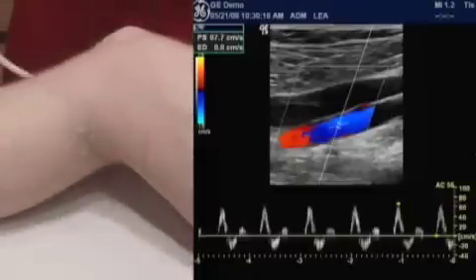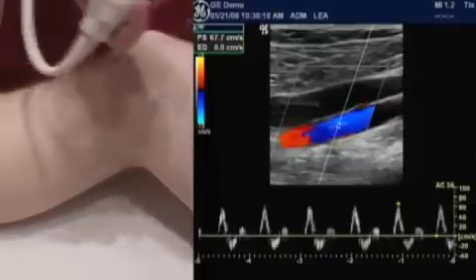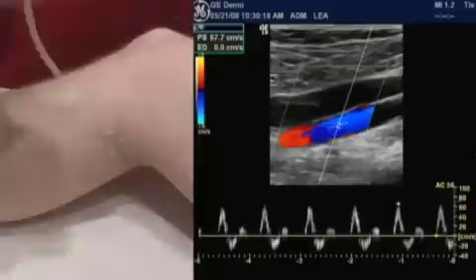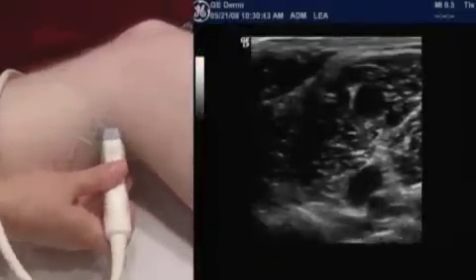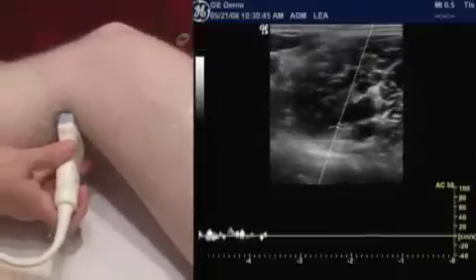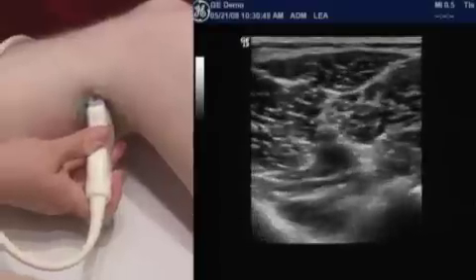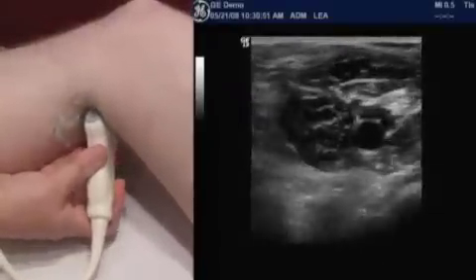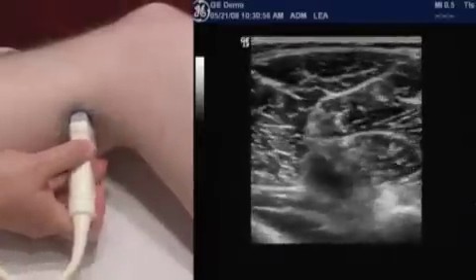As we go out the arterial tree, we expect the blood to slow down. We want it to slow down, so by the time you get to the capillaries, you have good exchange. So most folks record just a representative signal from the popliteal. Coming down, we'll come back to the anterior tib in a little while.